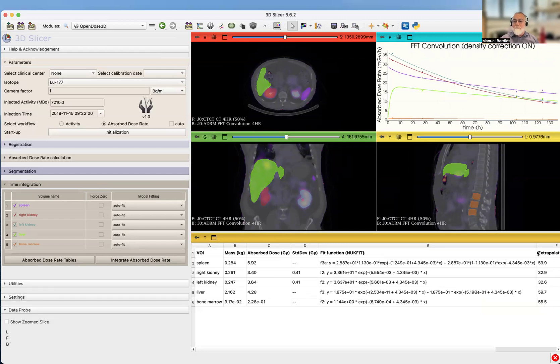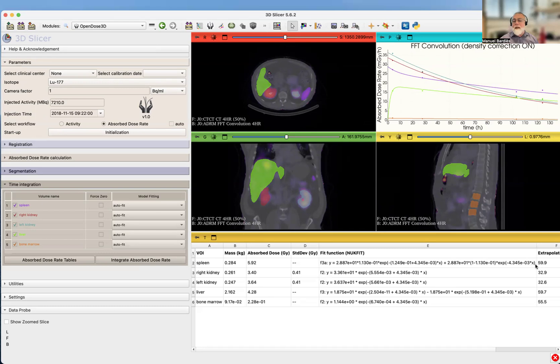You can see here that it can be quite high. 60% of the absorbed dose to the spleen has actually been extrapolated after the last time point.